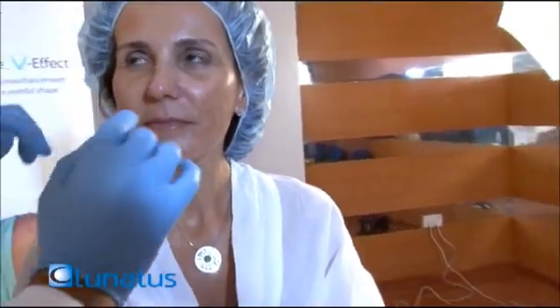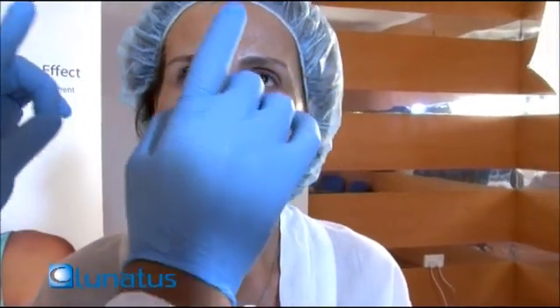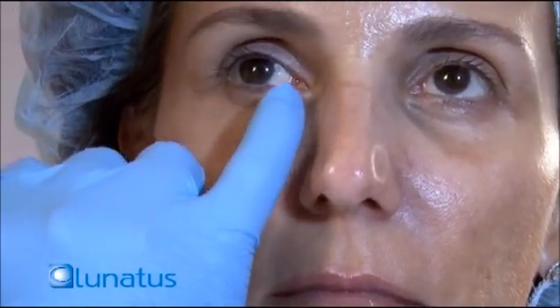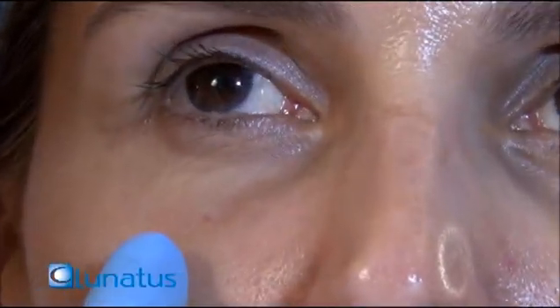Now, it's very important to know that since we're going to be injecting calcium hydroxylapatite today, you want to try to avoid the tear troughs themselves. You're not going to be injecting it. However, you can always inject the cheeks, and then you can use what we call the push bolus technique. You put a little bolus right over here, and you simply push it a little bit towards the upper side. Okay? Calcium hydroxylapatite is a white material, so it won't have that Tyndall effect with the thin skin of the eyelid, and it'll definitely fill up this area for her. Now, she might need a little bit of an HA sometime later on in the future, just a little bit on the sides there, but she may not, just by injecting the calcium, the Radiesse itself.